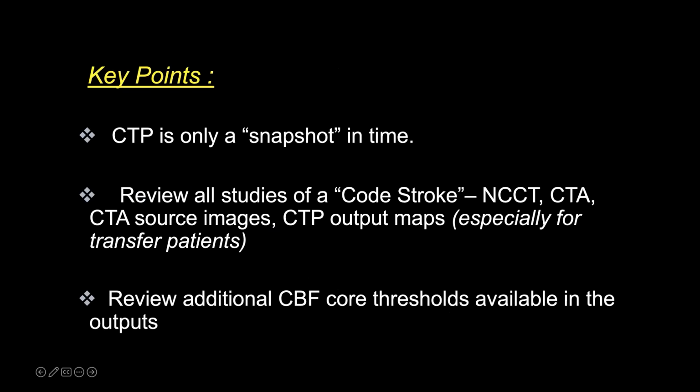CTP is only a snapshot in time, which means that there is a lot of dynamic things happening. The CTP is one point in time. It is critical to review all the studies of your code stroke, which means non-contrast, the CTA, the CTA source images. I find them incredibly helpful. The CTP output map, especially for transfer patients, if you don't have the rest of the imaging right in front of you. And also review the additional CBF thresholds that are available to you.